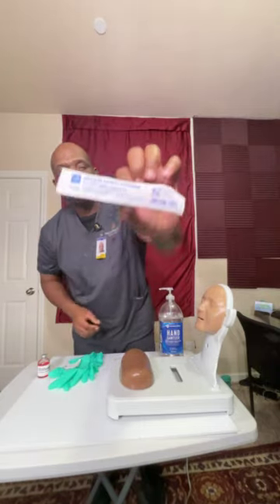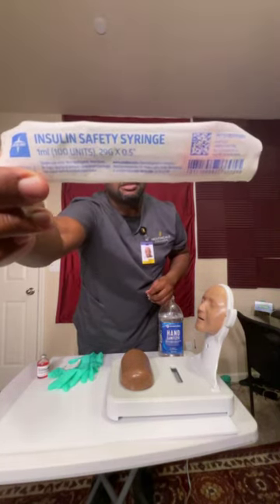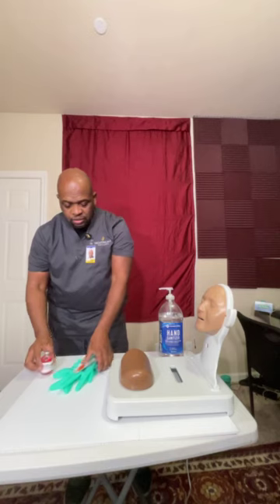This is what I have on supply and what was supplied to me. I'll go ahead and put that up a little closer. So that's the syringe. So we'll go from there. Because everything looks good with the medication against the medication administration records, I'll go ahead and count this as check number 1. As I said, I'll be doing these safety checks at least 3 times, verifying the 6 rights. So I'll go ahead and grab my items.